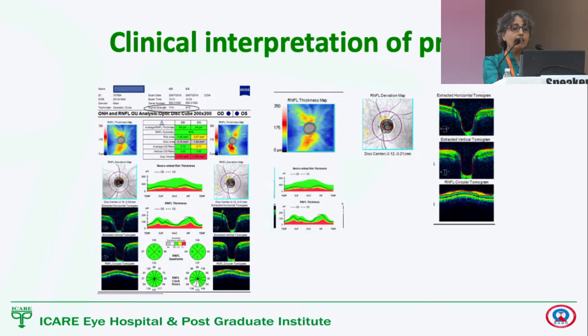What you see thereafter is your neuroretinal rim thickness being captured. And I think that is so important, which I train all my trainees and fellows and all that work with us, that what is important to look at in the disc is not the cup, it's the neuroretinal rim. Cup happens to be an outcome of the loss of the neuroretinal rim. So it is the rim that is important, and we all understand the normal topography of the rim that we see in healthy patients. And this rim thickness is being measured.